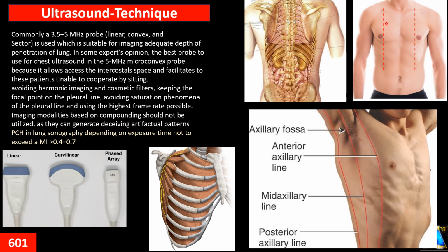Usually, when we see sagittal, we see those ribs that show us it is sagittal. But generally, we have to annotate location and orientation and the side of the chest, right, left, upper anterior, lower anterior, and so on.